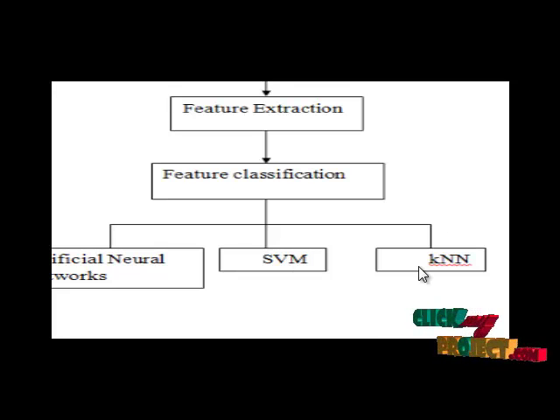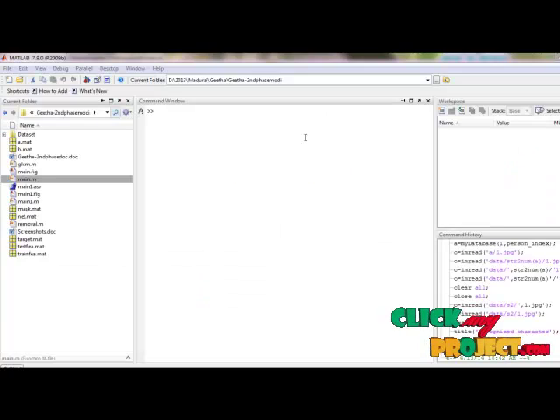Then KNN works where both the distance metric and the number of neighbors can be altered. The object classifies new observations using the predict method. The object contains the data used for training, so it can compute resubstitution predictions. Then it will predict the results. Now let us see the execution of the process.